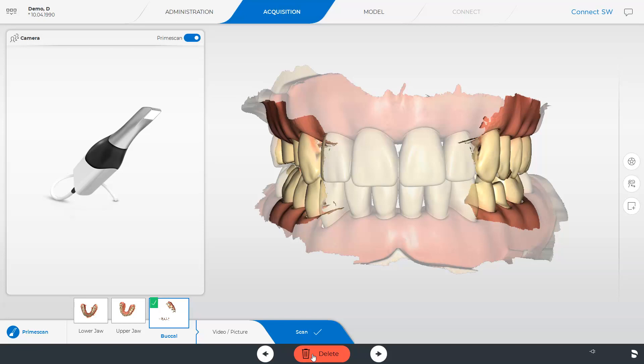Detailed information covering the scan process can be found in our video tutorial on the topic of partial scan or full jaw scan with CEREC PrimeScan. Once a green check mark is displayed in the buccal image catalog, we can switch to the next phase, the model phase.